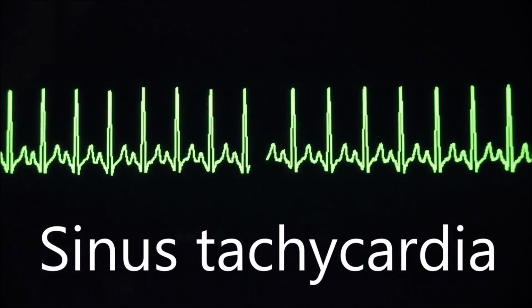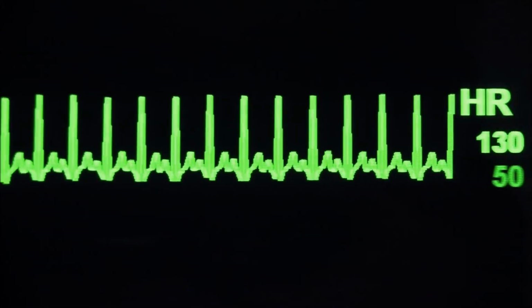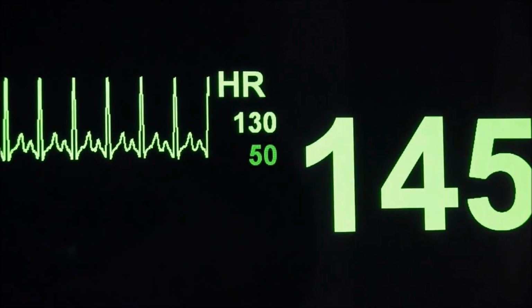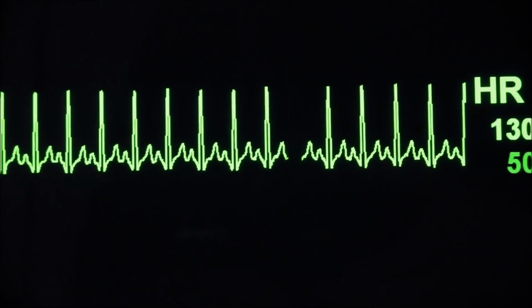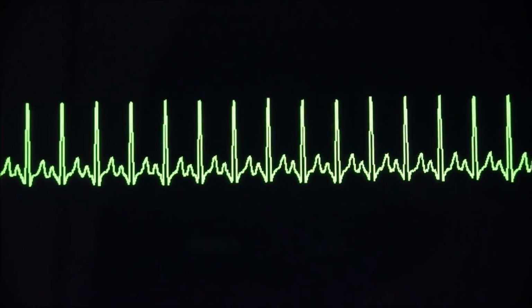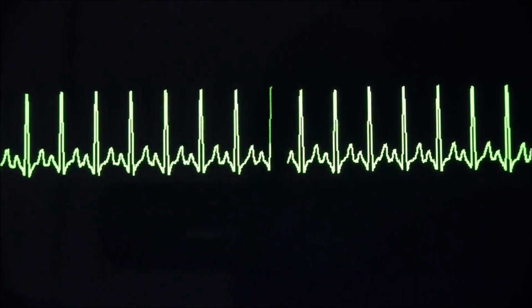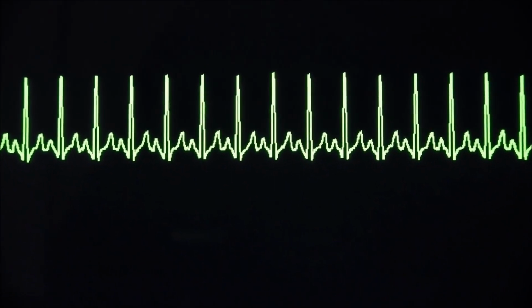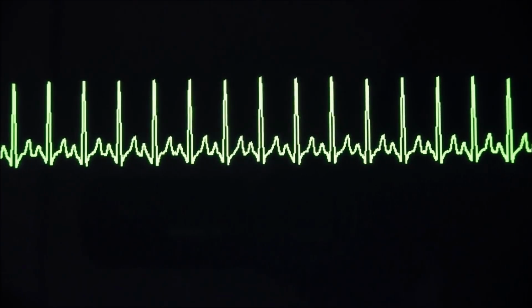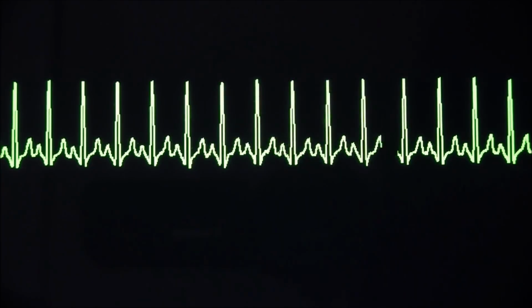Now here we notice the machine's alarming again because it doesn't like this rhythm, it's far too fast. And we can actually see on the monitor that it counts it for us. This patient is now very tachycardic. They have a fast heart rate. So a tachycardia has got a PQRST, and I think you can see there's a PQRS and a T on this. It's all just a bit concertina together, it's all a bit close together because it's running fast. So a sinus tachycardia, PQRST, right order, fairly regular, but the rate is over 100.